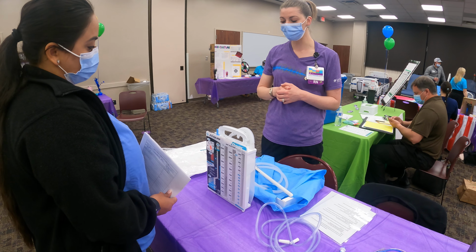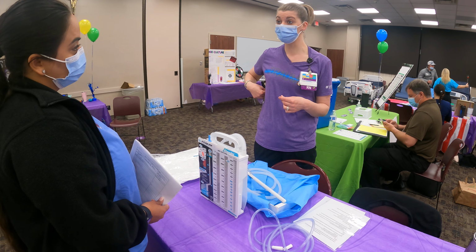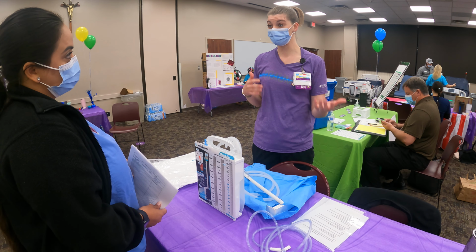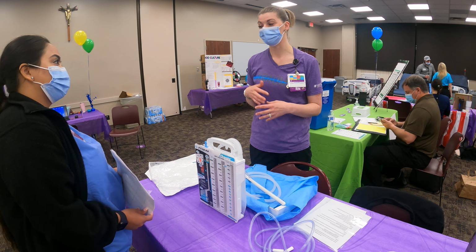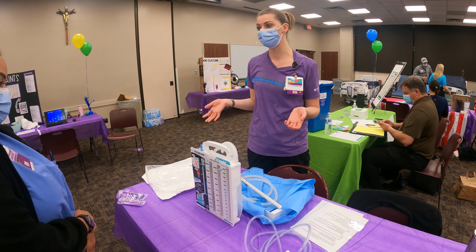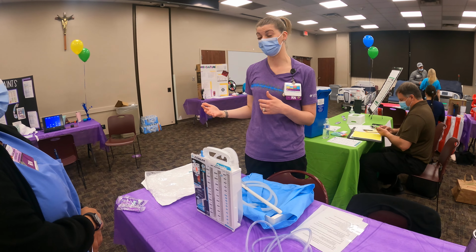Okay? As far as dressings are concerned, there is a suture in place where the chest tube is inside the chest wall. You need to change that dressing every day and PRN. Okay? So sometimes they leak, sometimes they have saturation on the dressing, but they need to be changed PRN and every day. Because that's part of your assessment, right? So we need to be looking at that.